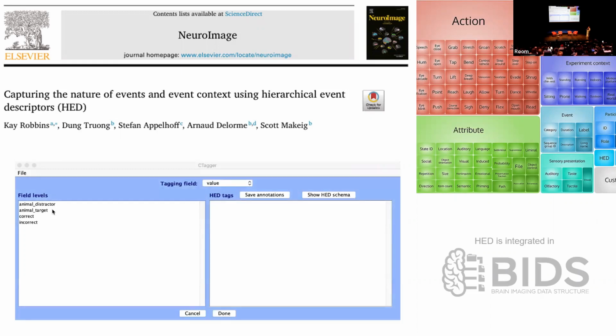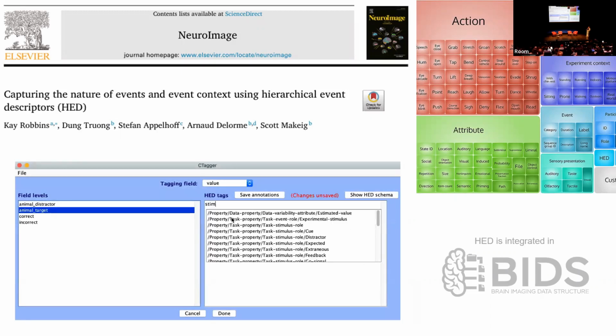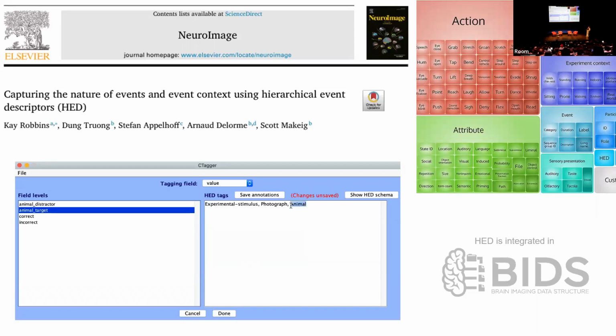For example, once you have already recorded the data in EEGLAB, there is a tool for creating HED tags where you can associate different keywords with your stimuli, just to make it more clear if someone ever wants to reanalyze it, or also to make it machine actionable.